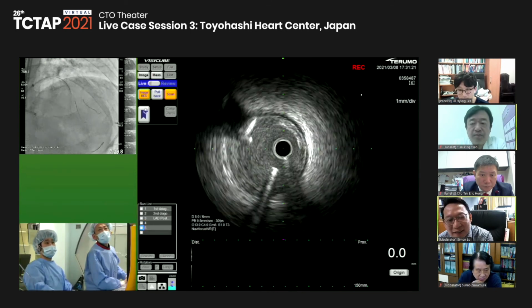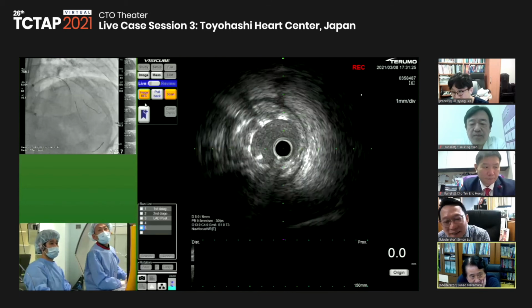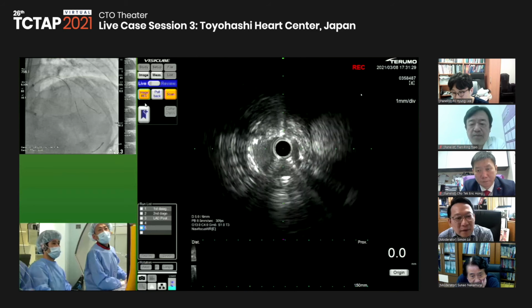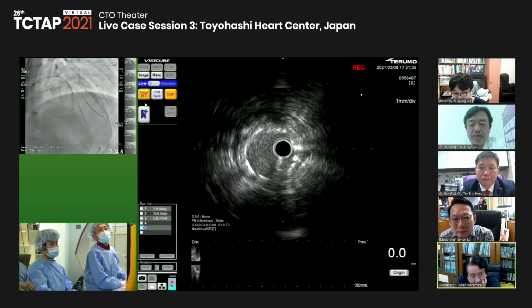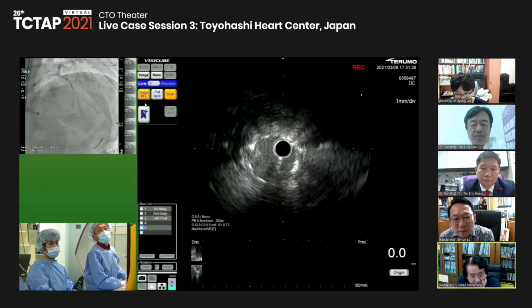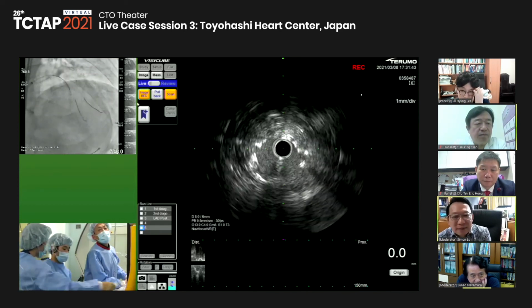Usually, 3.5 POT, then kissing balloon, then POT. This is the usual way. Okay, the final kissing inflation first, right? Yeah, POT, KBT, and POT. This is the usual way. KBT followed by POT. It depends on the operators.